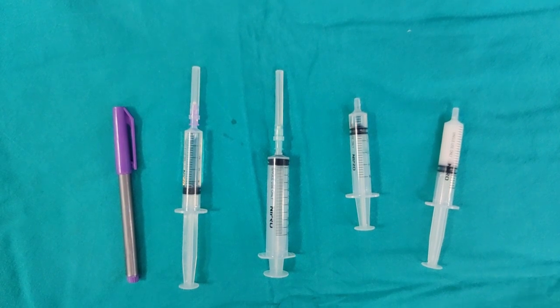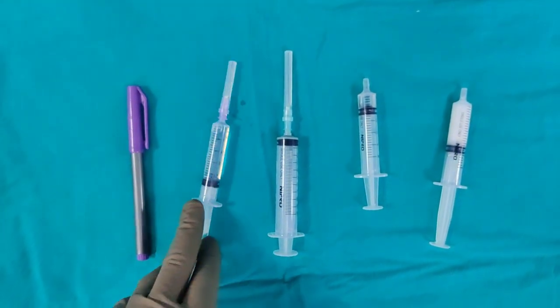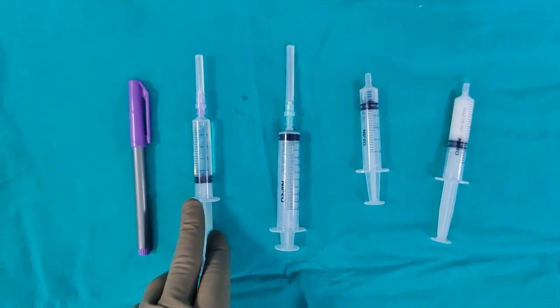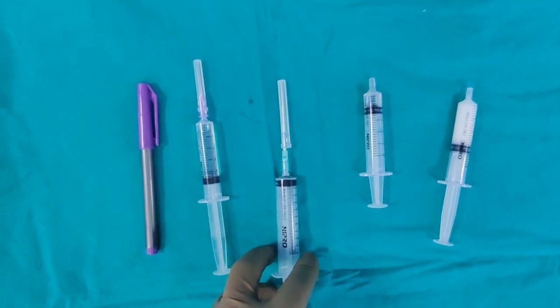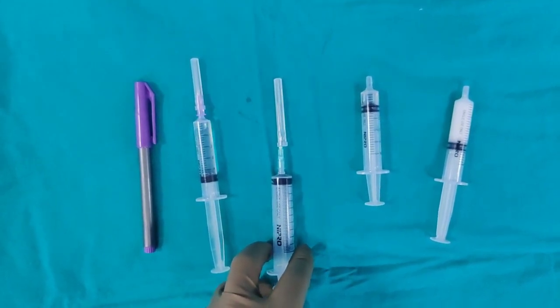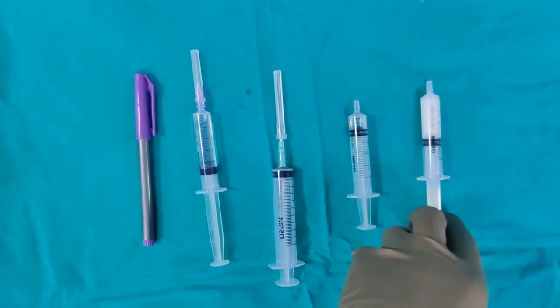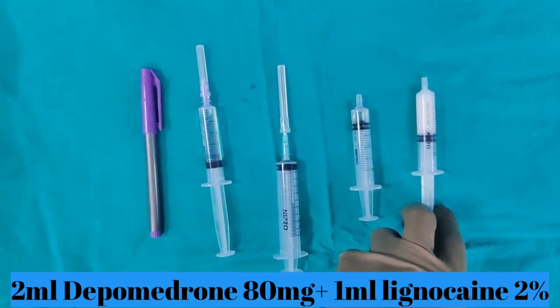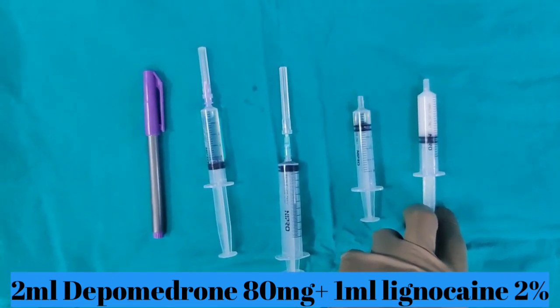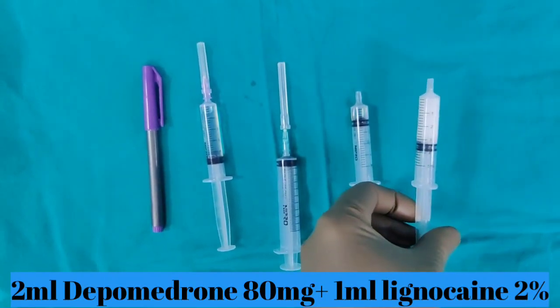Now, this is what you need to do this procedure. Of course you need a marking pen. This is some local anesthetic that we will give on the skin just to make it as less painful as possible. This is the needle I am going to use to negotiate into the ankle joint. This is the OmniPaque dye to confirm our position, and this is the steroid — a mixture of 2 ml of Depomedrone, which is around 80 mg, and 1 ml of local anesthetic, so in total it is around 3 ml.